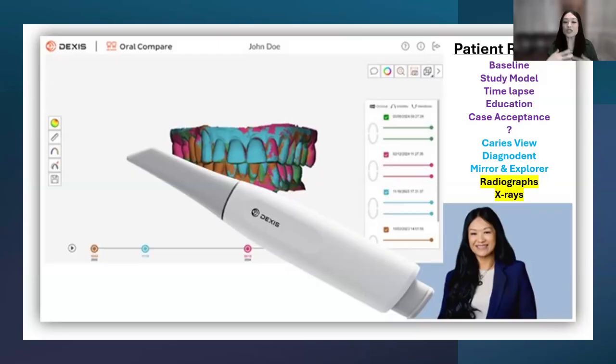So then we evolved and we had something that was called a caries view. Oh, we're techie now. It looked like a little black gadget. It had a little bit of floss or something in between where we would check and get these little light reflections to see if there were signs of maybe some interproximal decay. So that was the caries view for interproximals.